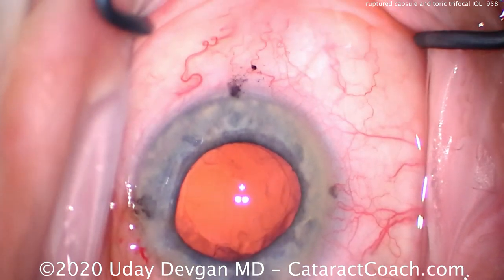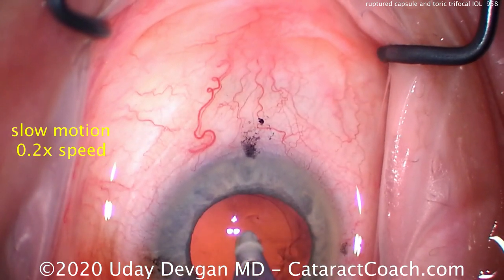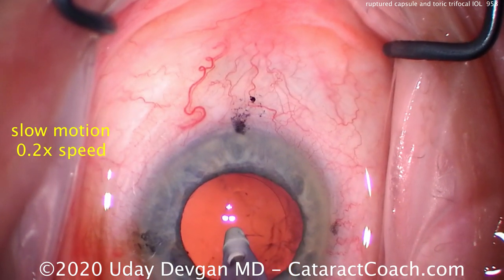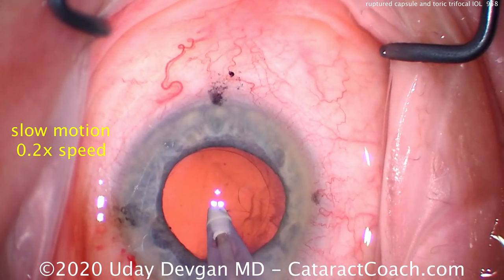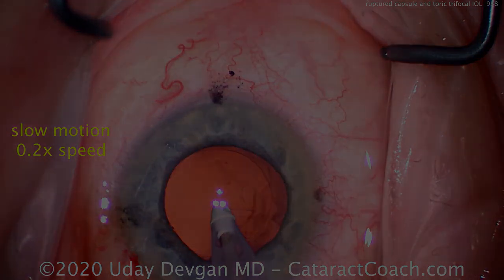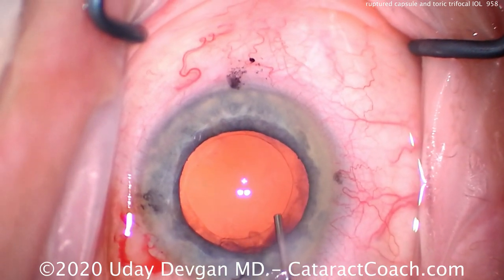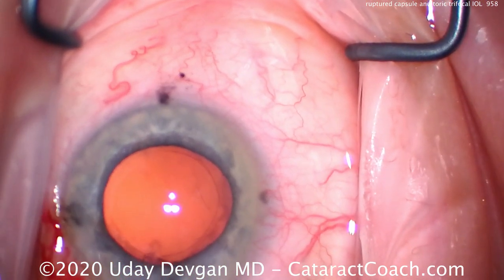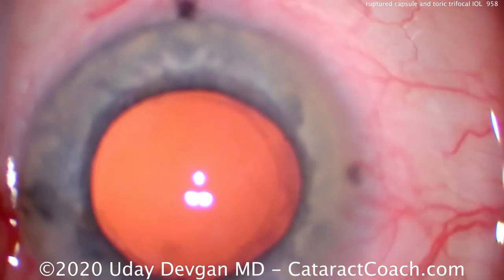Now it's been stabilized. Let's watch in slow motion again — just cleaning up the posterior capsule, we just happened to find a weak spot where that suction was enough to open the posterior capsule. This is the balance: you're cleaning off the posterior capsule, you've got to be careful. In some cases, even if you do nothing wrong, you're still going to get a weakness and you can still get a break. So we filled up the eye with viscoelastic.